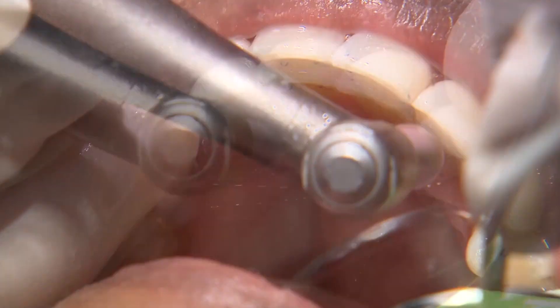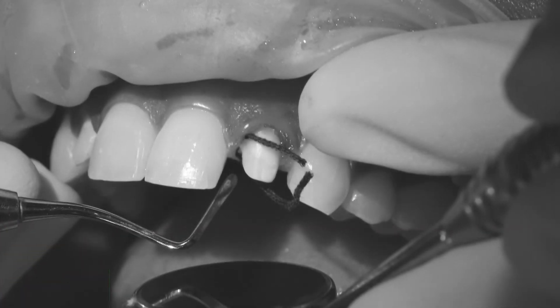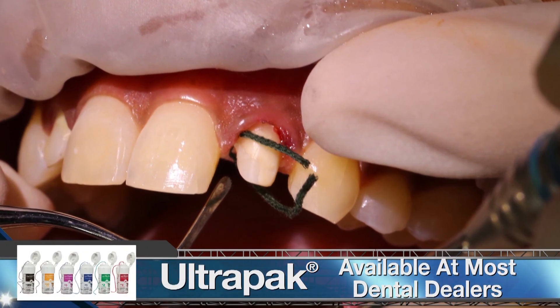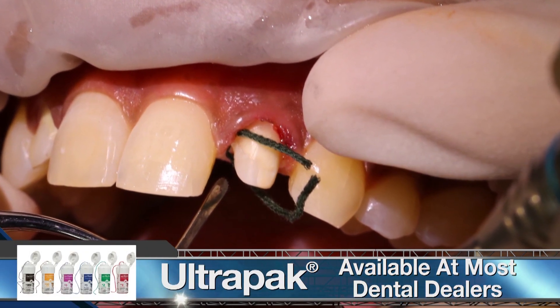To expose a bit more of the prep and protect the sulcus from excess cement, I pack a size triple zero cord around both 7 and 10.